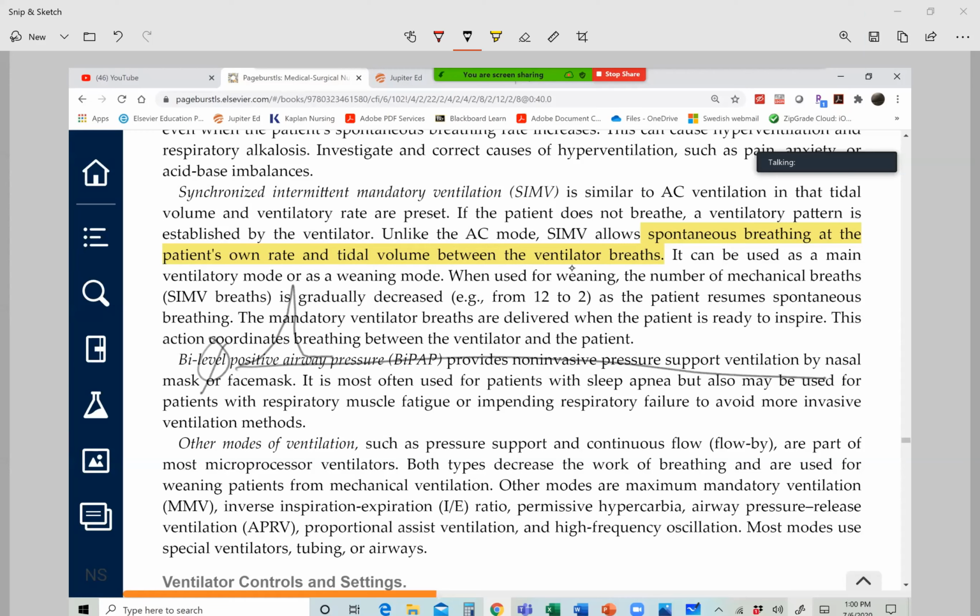Do what exactly manually? I mean the rate, to decrease the rate of the breaths, 12 to 10, 10 to 8. You have to do it manually. We can't set it automatic because you have to check the patient first. The vent won't know whether or not the patient is getting better. It's still a clinical judgment.